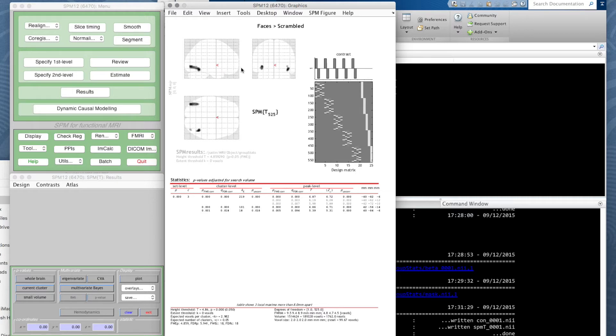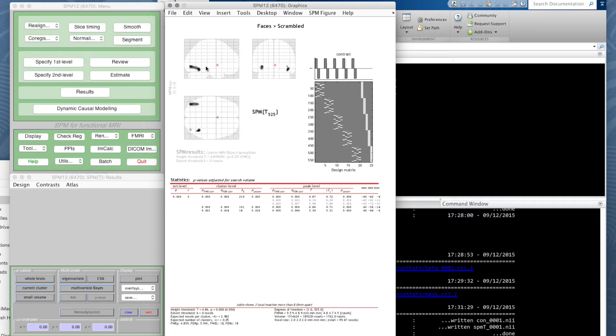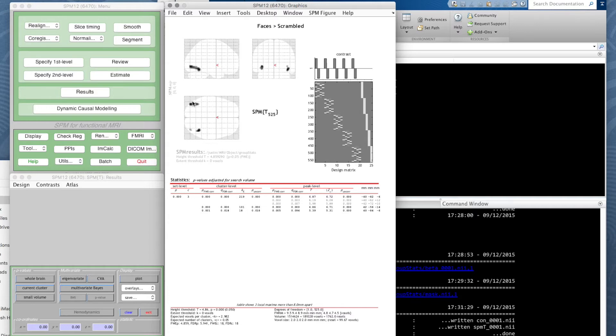In this top left sagittal view, where we have the y-axis, y values going from anterior to posterior, z values going from bottom to top, the x values go in and out of the screen. So whatever the laterality of something, it will show up in here.